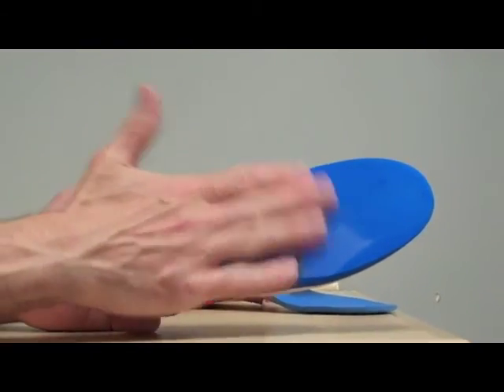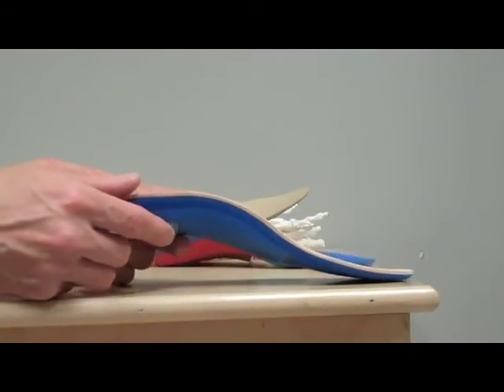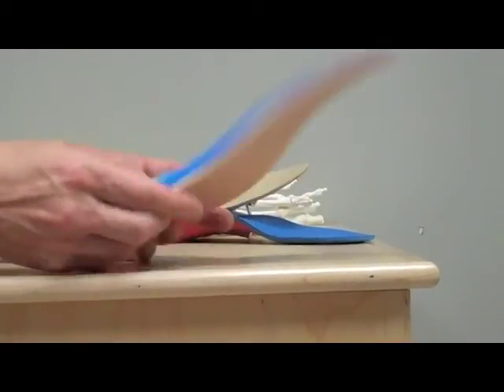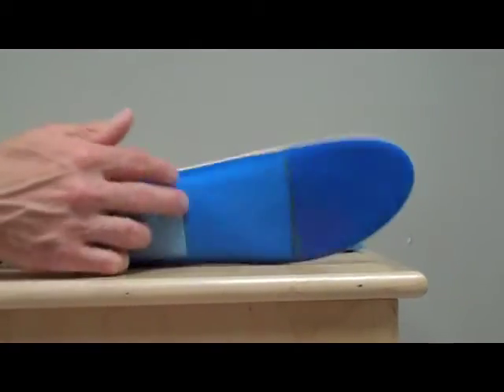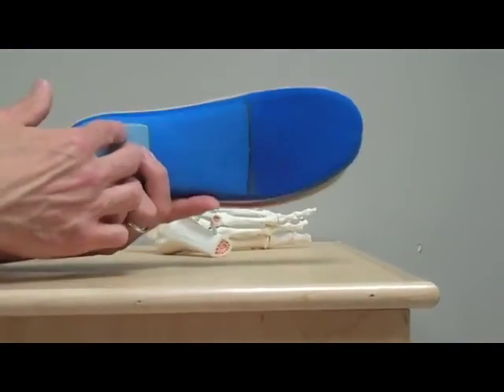So, of course, what I do is dictated by what the patients tried before, what kind of shoes they have, how sensitive their feet are, how much they weigh, how sedentary or active they are. So there's a lot of things that factor into this. But this at least gives you a couple options for what I do in the clinic. And that's it for orthotics for plantar fasciitis.